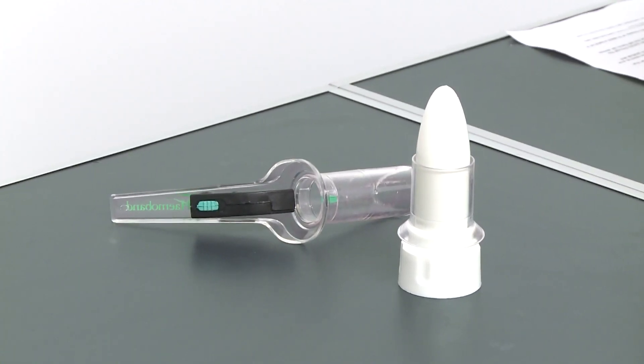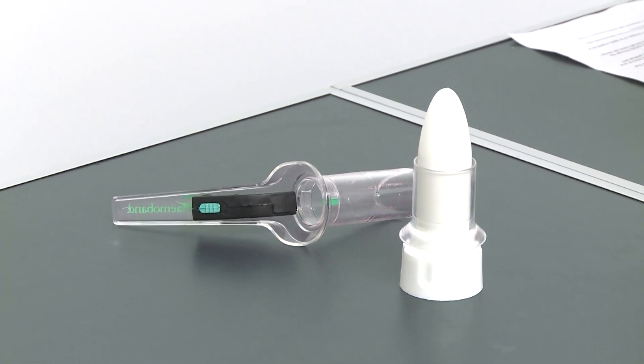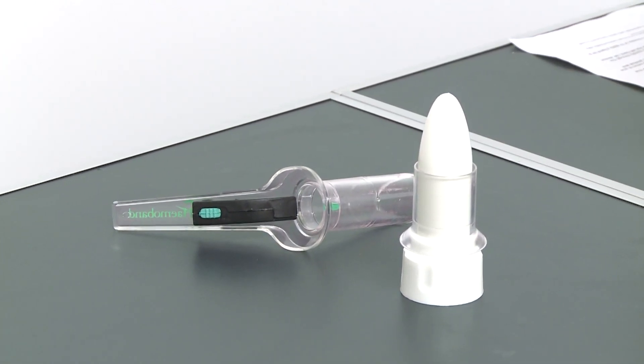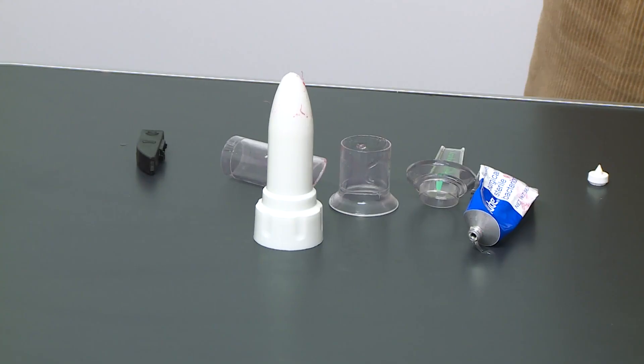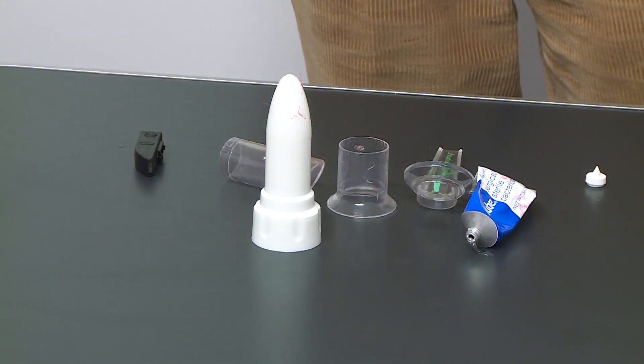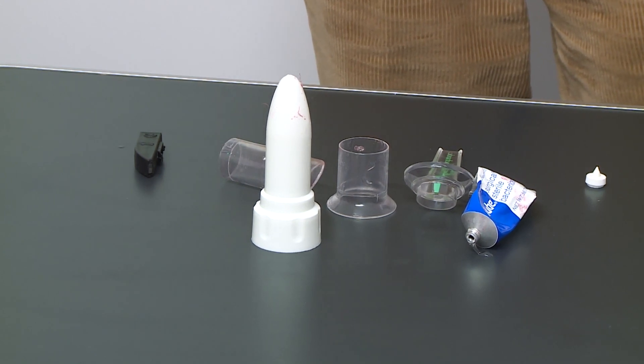I am also the inventor of the SleeveLUX Proctoscope. The Haemoband SleeveLUX Proctoscope is a single-use, disposable, self-illuminating proctoscope, and it has a unique feature — the presence of the sleeve.